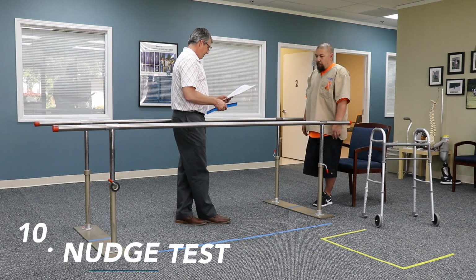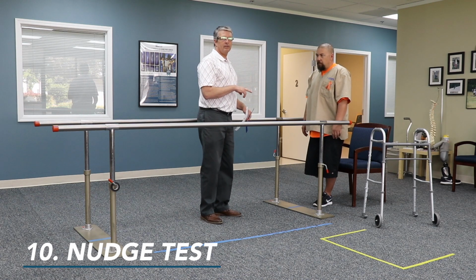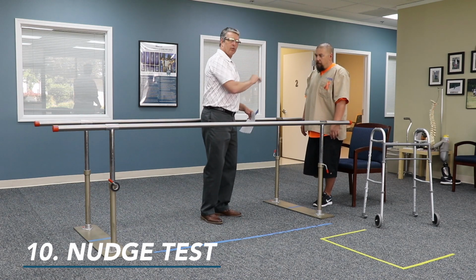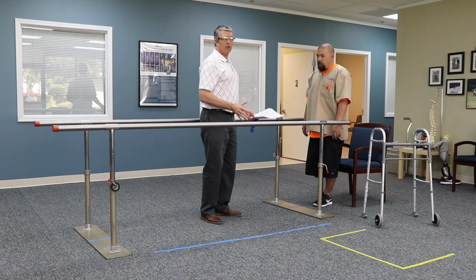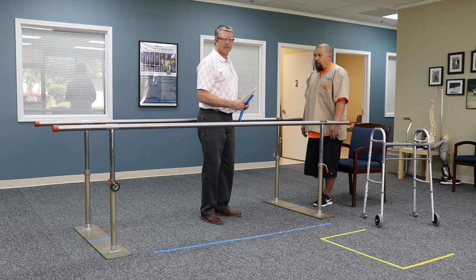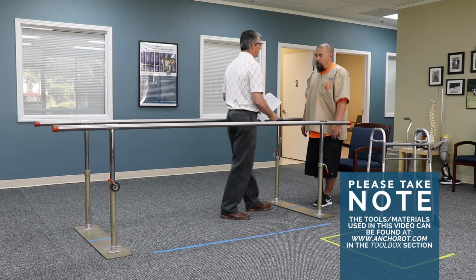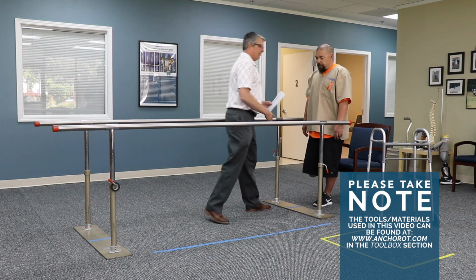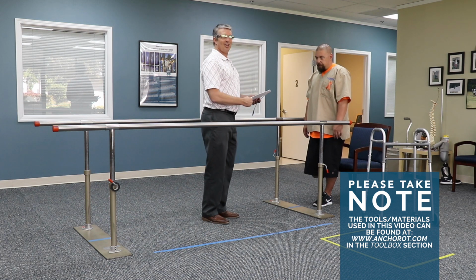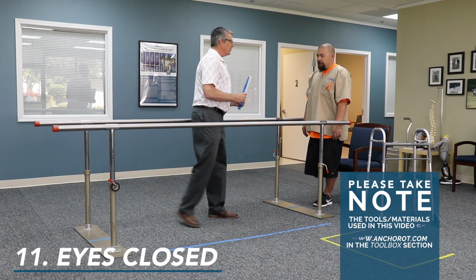The nudge test, okay, especially without a prosthesis on. We're going to come in and do the 3 taps on the chest, have a chair behind them, and have an assistive device available just in case. Or if your patient's uncomfortable doing it and you're uncomfortable, don't do it at all. Very successfully and stable. Pretty amazing. And then the eyes closed.